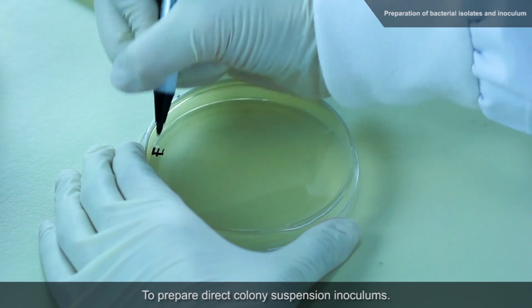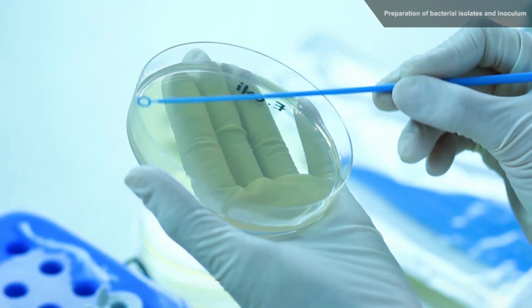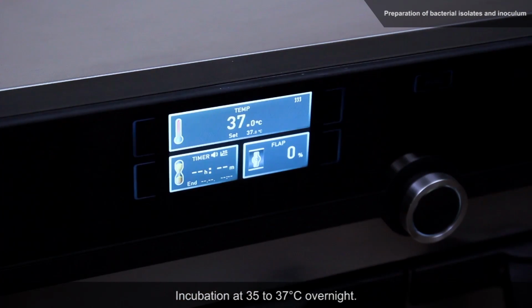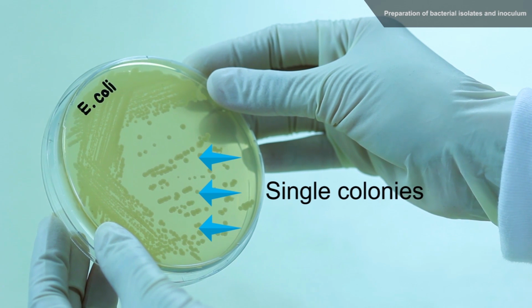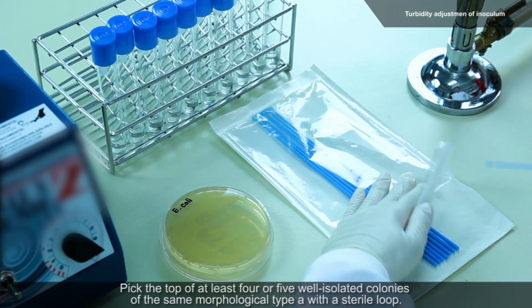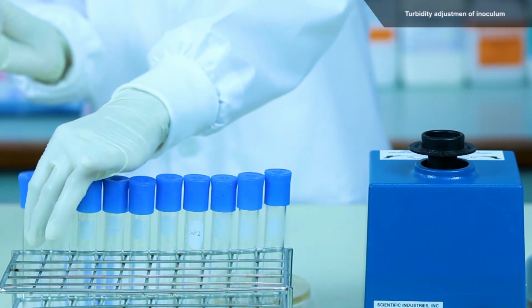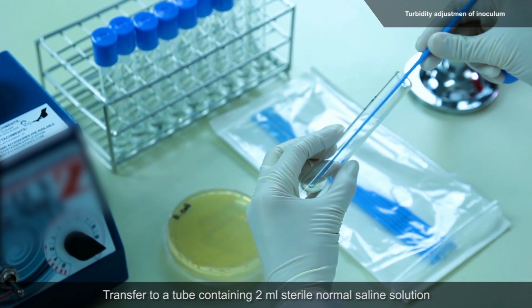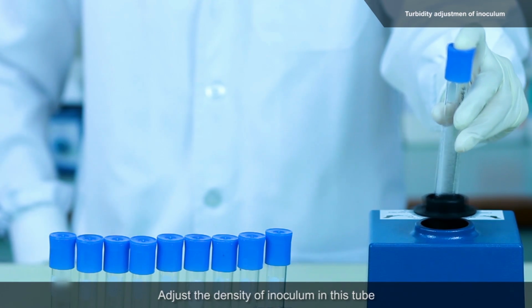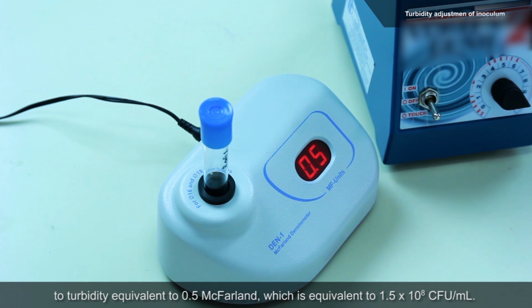To prepare direct colony suspension inoculums, streak the bacterial strains on Mueller-Hinton agar to get single isolates and incubate at 35 to 37 degrees Celsius overnight. Pick the top of at least 4 or 5 well-isolated colonies of the same morphological type with a sterile loop. Transfer to a tube containing 2 milliliters of normal saline water and mix. Adjust the density of inoculum in this tube to turbidity equivalent to 0.5 McFarland, which is equivalent to 1.5 times 10 to the 8th colony-forming units per milliliter.